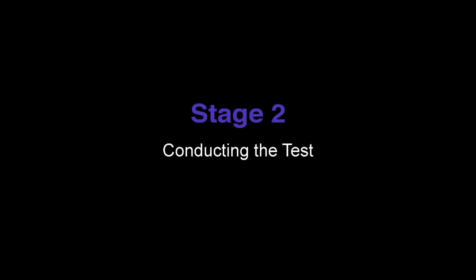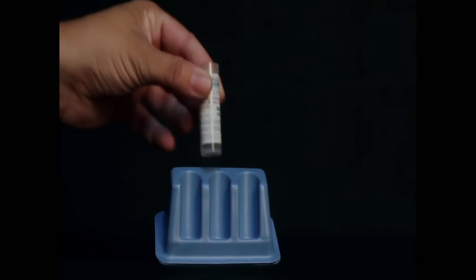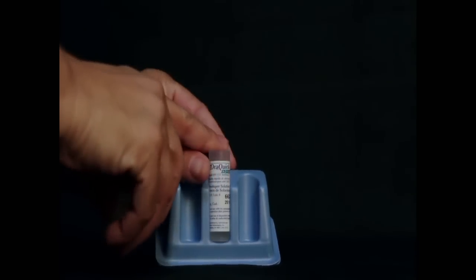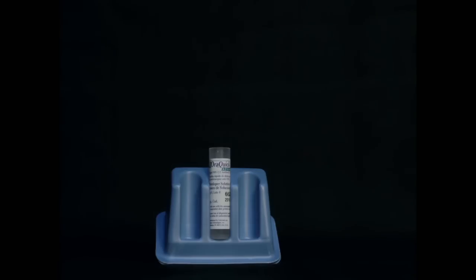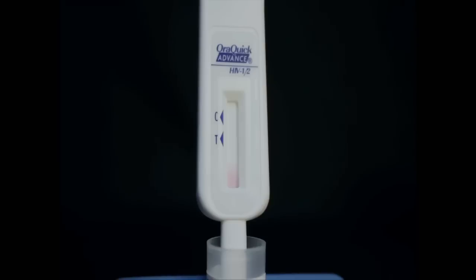Stage 2: Conducting the test. Insert the flat pad of the test device all the way into the vial. Make sure that the flat pad touches the bottom of the vial. The result window on the device should be facing toward you. Start timing the test. Do not remove the device from the vial while the test is running. Pink fluid will appear and travel up the result window.